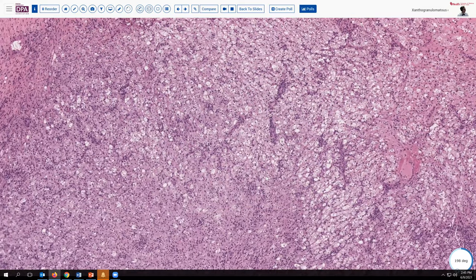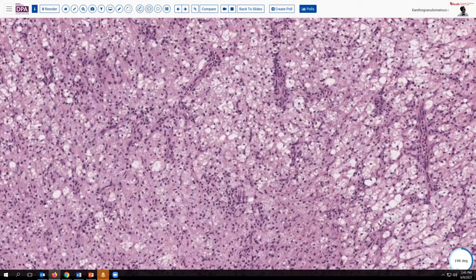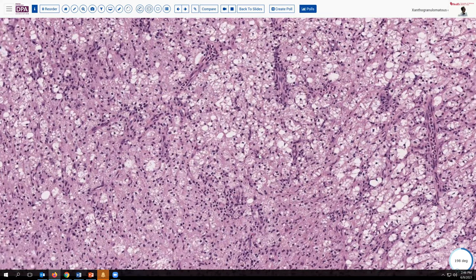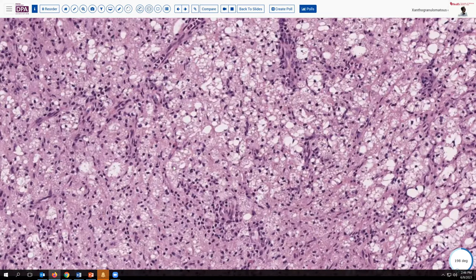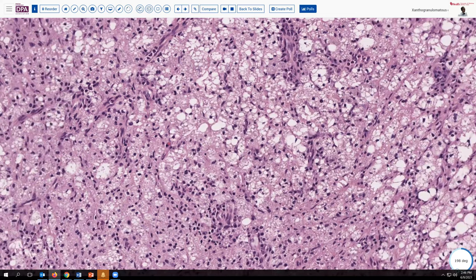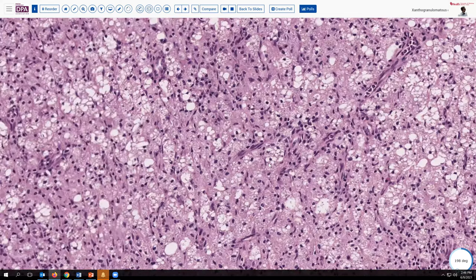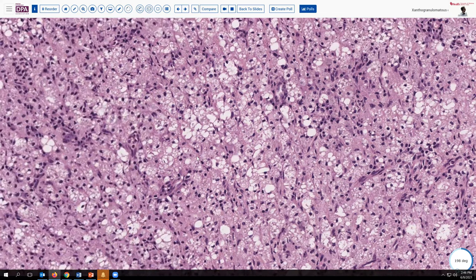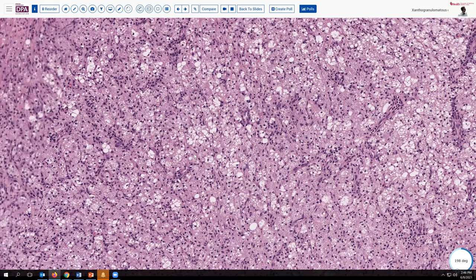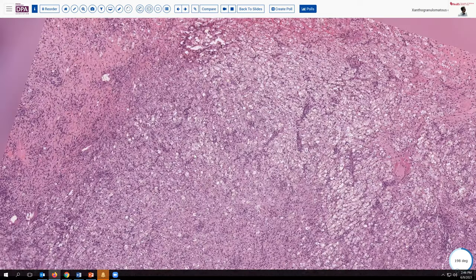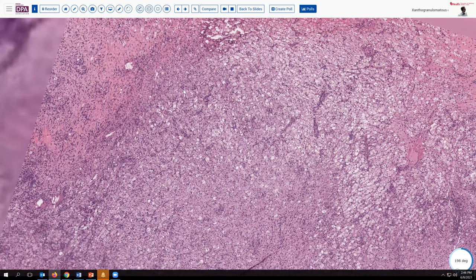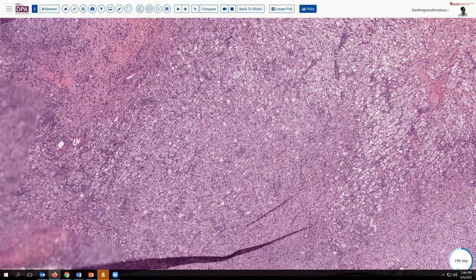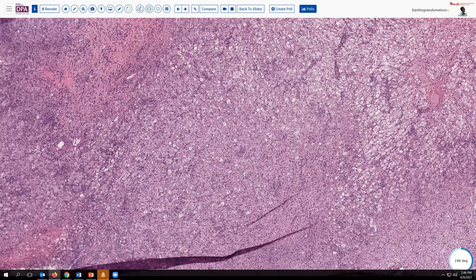However, as we come into this, we can see that the nuclei are not very striking and we have lots of very foamy vacuolated cytoplasm. So in reality, what we're seeing here is a collection of foamy histiocytes in the gallbladder wall.